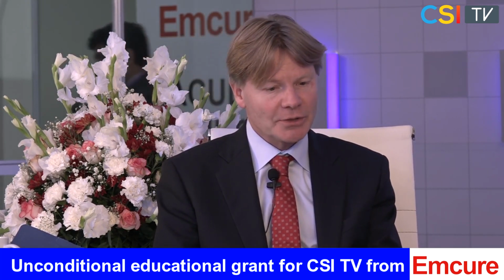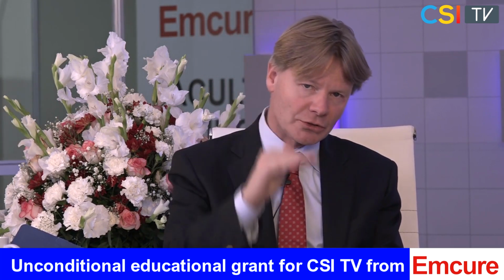Well, thank you. For the moment, we're just learning that there is more than ejection fraction. And by doing that, we start understanding what ejection fraction is. As I said, volume in, volume out. So we're shifting away from the volume shifts going to the ventricle and really looking at what's happening in this ventricle. If we start doing that, we started with the longitudinal strain, which is the up and down deformation.